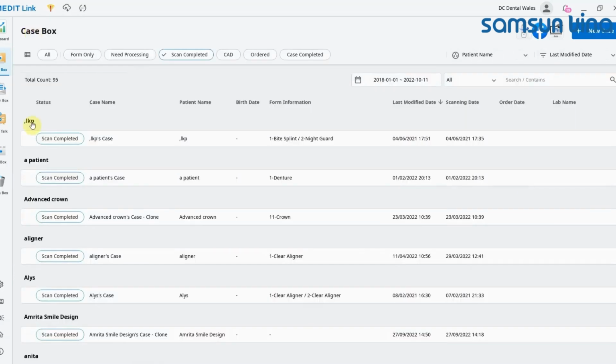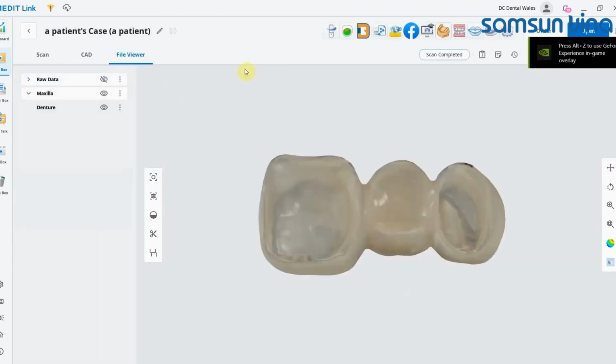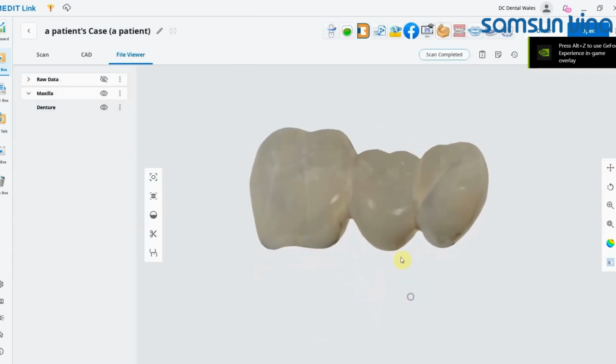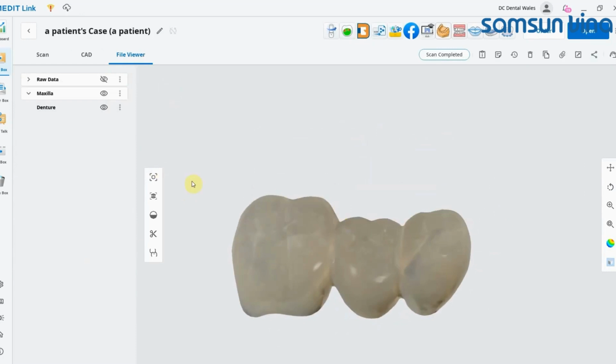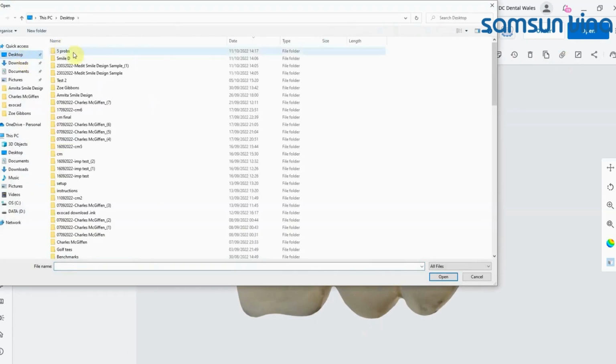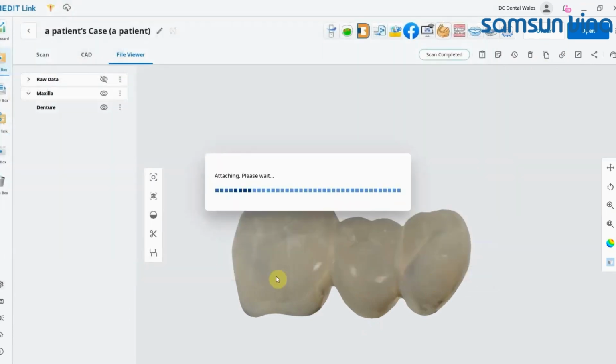Okay, so the final question we're going to go through today, which is really common, is how do I attach files, usually photos, to a case? Okay, so we're just going to pick this random case. I was messing around scanning a bridge, but we want to attach photos to this case. So all we do is we go to the attach icon, and then we find the location of our photo, and then we can highlight the ones we want. So this is for a smile design, for example, and press open.